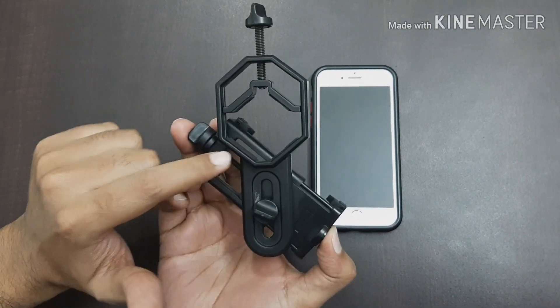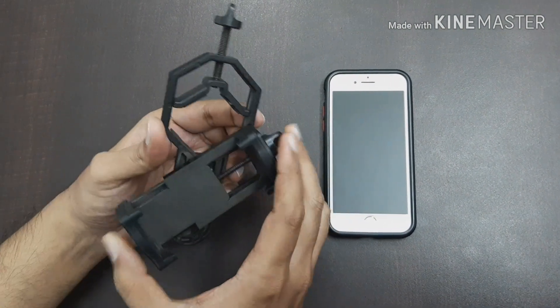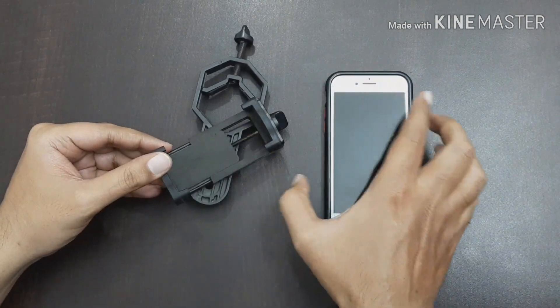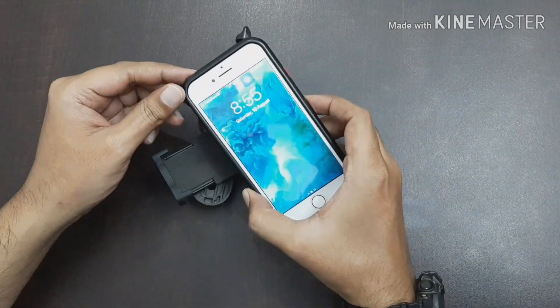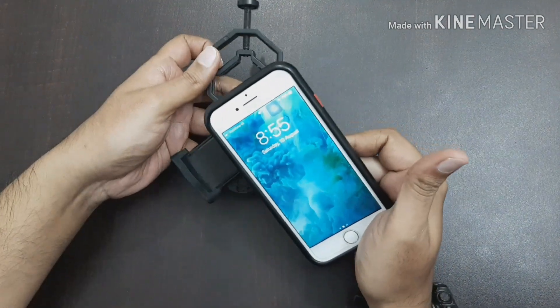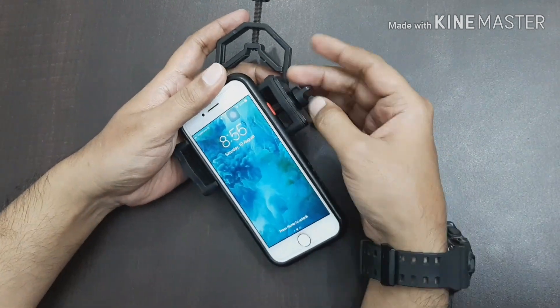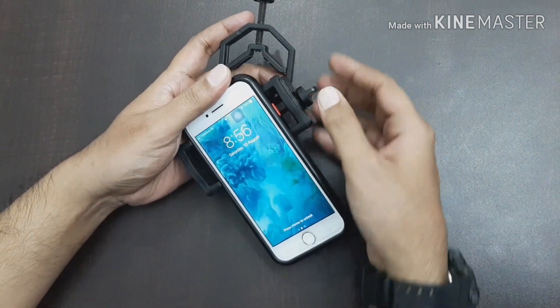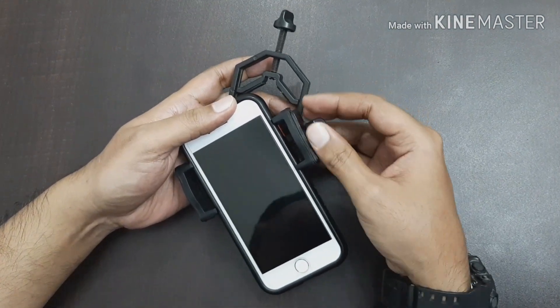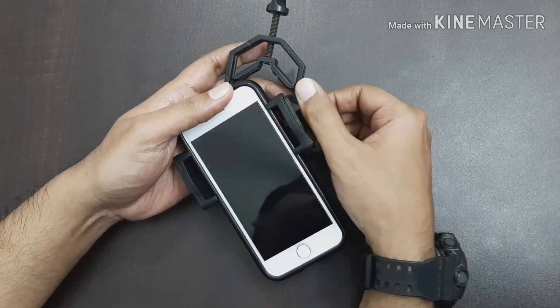Once you get this adapter, all you need to do is fix your smartphone on it. Make sure you know where your camera is positioned on your smartphone. Slowly insert your smartphone onto the adapter — you'll have to loosen the knob so that your smartphone fits in quite well. Once it's fixed in, tighten the knob.